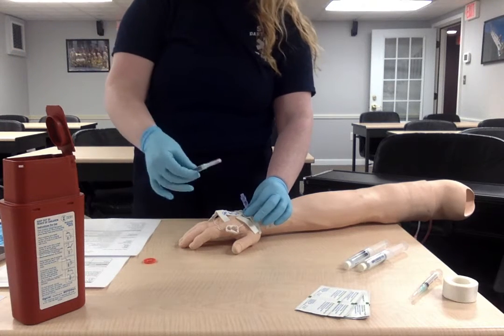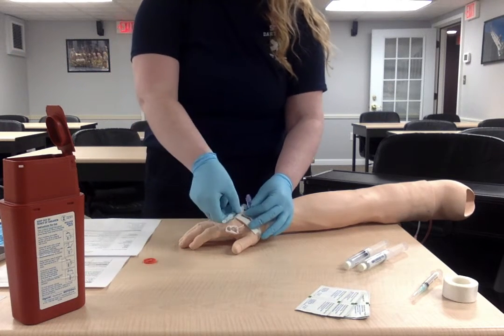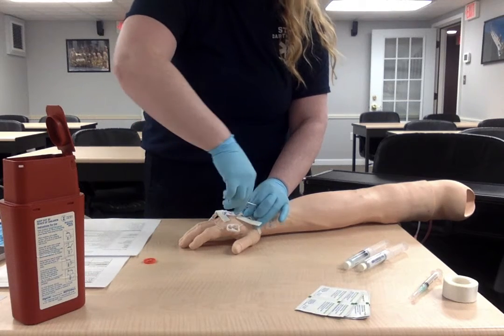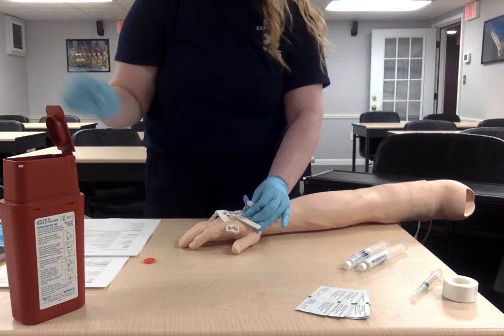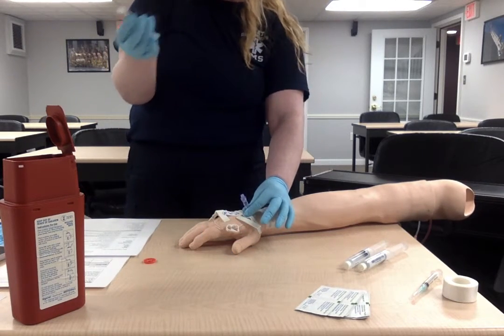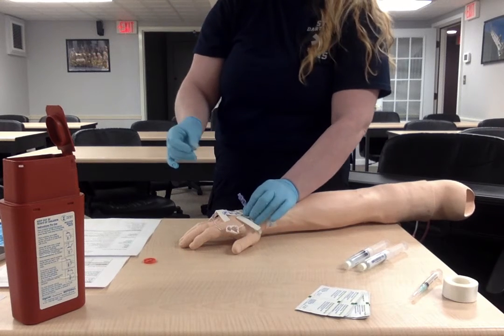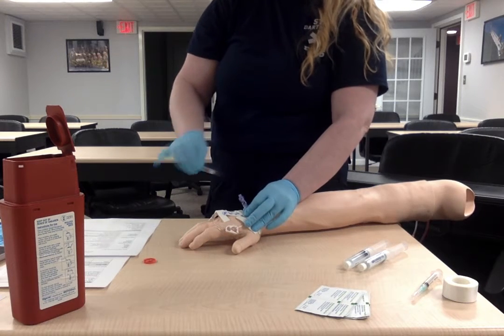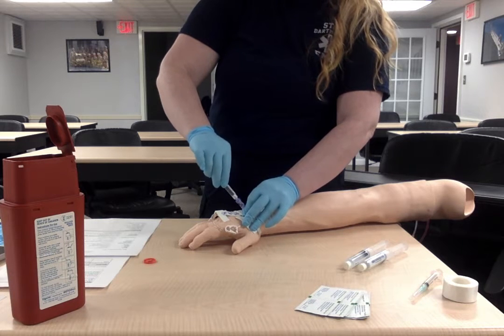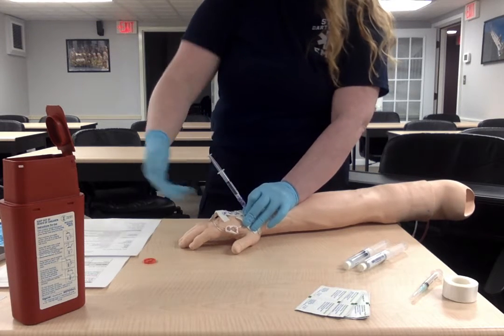And we want 0.5 milligrams. So now that this is all set, we can DC the needle that we used to draw everything up. We're going to make sure that everything stays sterile and doesn't touch anything. This goes directly in our sharps container. We're going to use a needleless system to prevent any injuries, and this is the system this hospital uses. So we're going to attach it now that it's dry, everything's staying sterile.